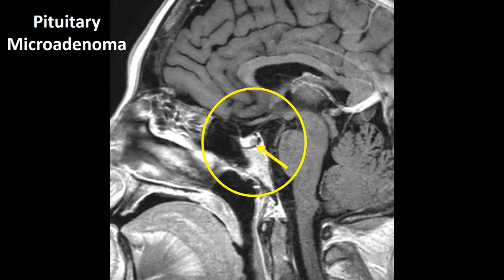Normally, we're used to seeing this on a coronal. That's usually the way it's depicted. I always look at the coronals, and the coronals are usually where you pick it up, and it's easiest on the coronal to tell if it's the right or the left side. I just thought this one was one of the rare instances where it was beautifully conspicuous on the mid-sagittal, and this would be a great example to show, because it's not the plane that you're used to. But see, you have to be able to do that.